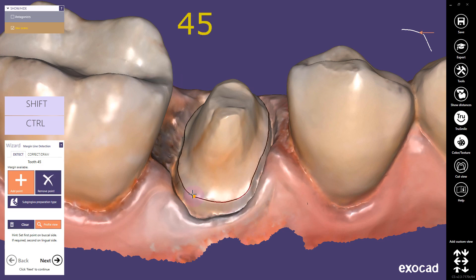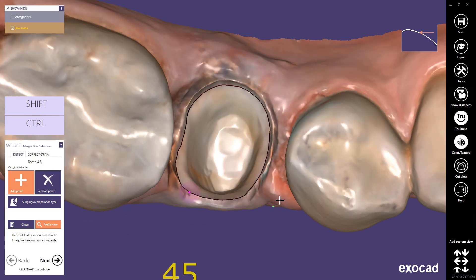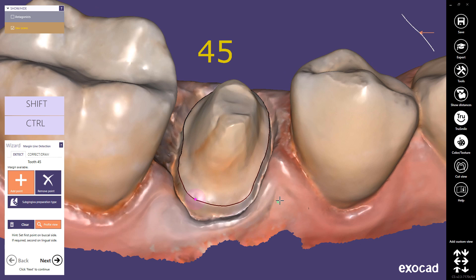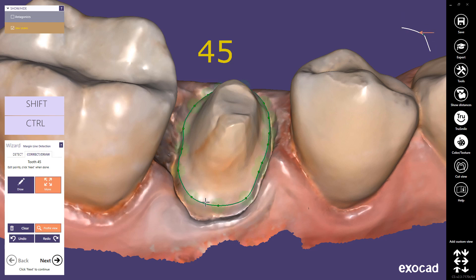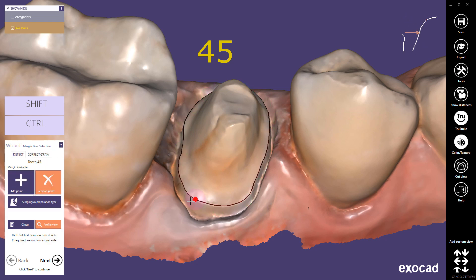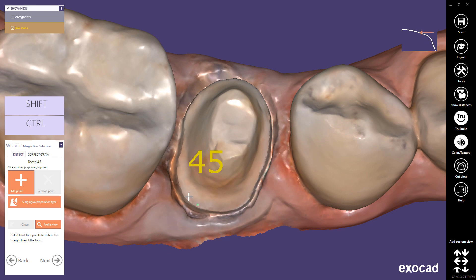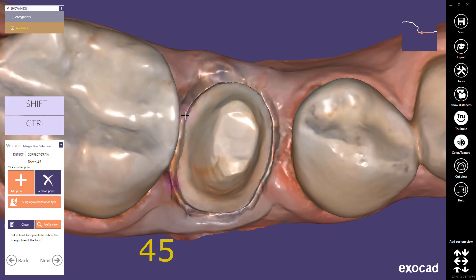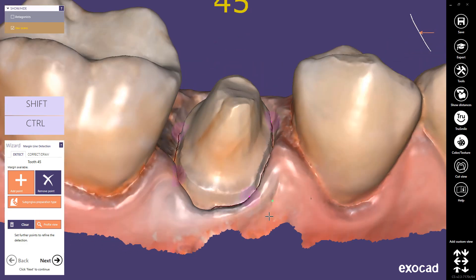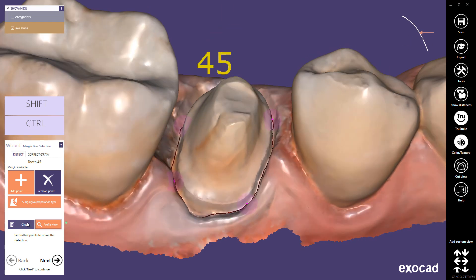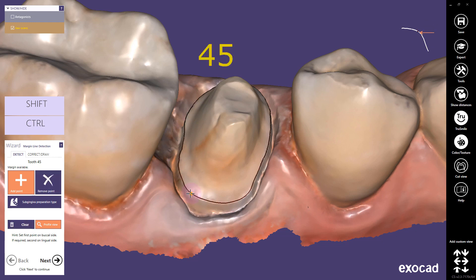Click on the buccal margin line. If the margin line has not been detected correctly, you can help the algorithms by adding one or more additional points on the margin line. Alternatively, select the Correct Draw tab to adjust the margin manually. You can remove points by choosing the Remove Point option or using Shift and mouse click on the point. If the subgingival preparation type is checked, the detection will follow a concave feature line on the scan data — in this mode, four points are required. Deactivate subgingival preparation type if the margin line is not below the gingiva.